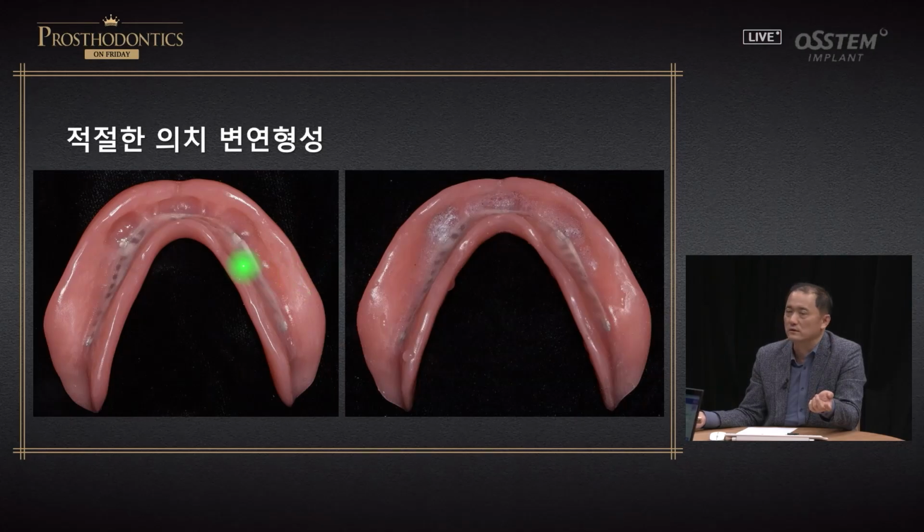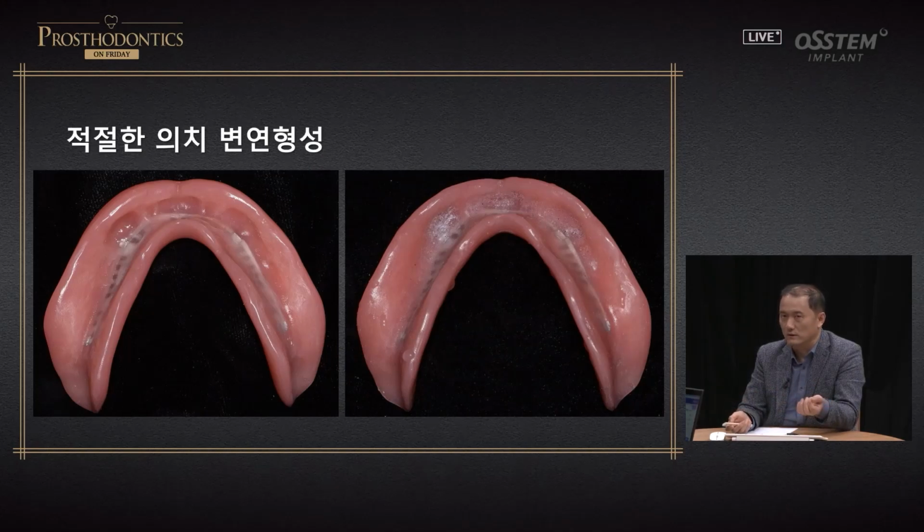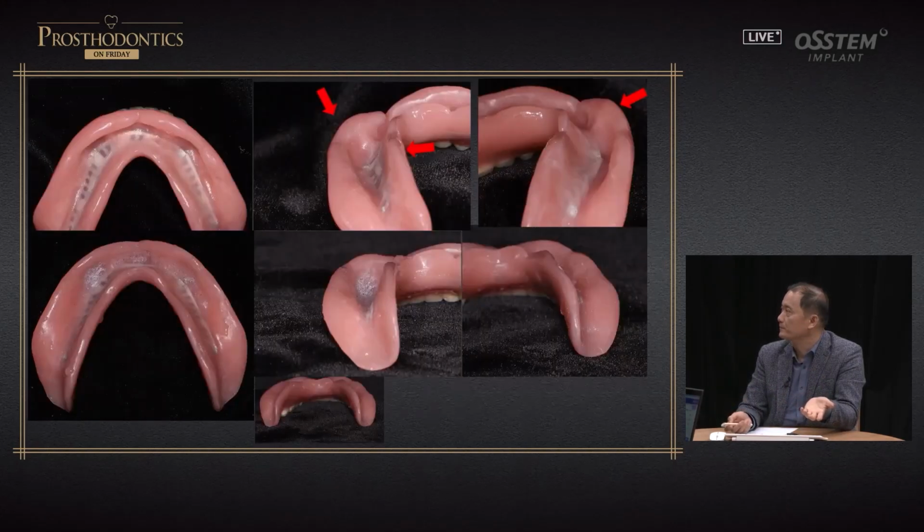So this denture, after it's been completed using fit checker, the border has been adjusted and is complete. So the thickness on the lingual and labial side, you see, has become thinner. Then has the retention become weaker? No. As I've talked about the case early on, the photo you have seen is actually these ones. So in terms of retention, there's no change.